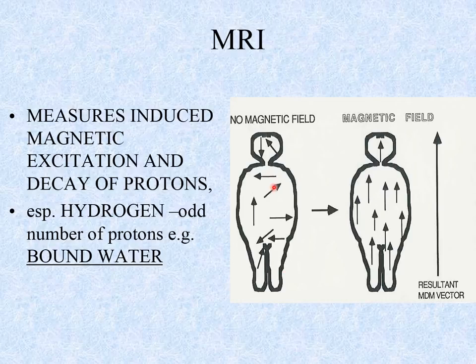That's shown here, a variety of molecules, particularly those that have bound water, hydrogen is included.